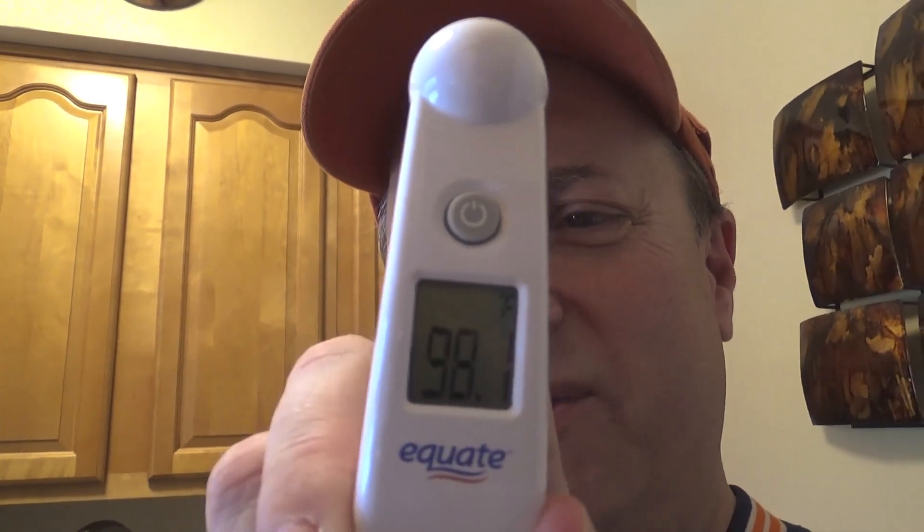Just wait for it to beep — there it is — and it says 98.1. So I'm good to go. That's how easy it is to use. Let me show you one more thing before we put it away.